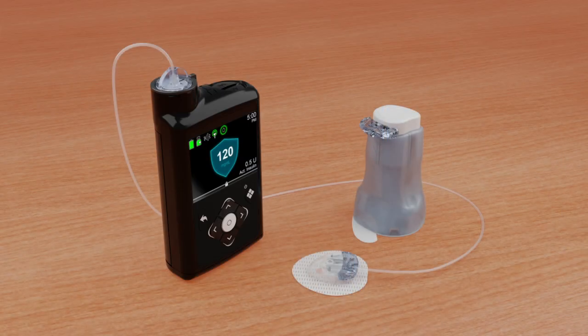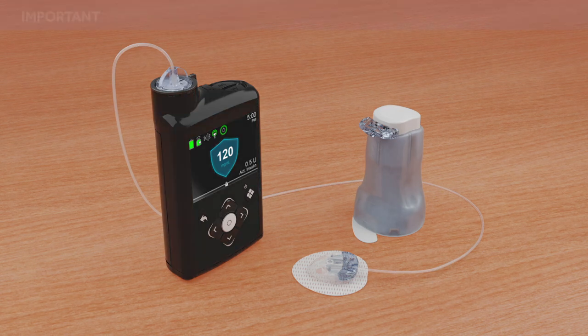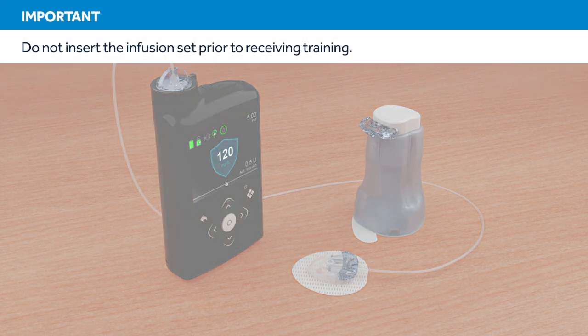This video will show you how to fill the reservoir and insert the infusion set. Do not attempt to insert the infusion set prior to receiving in-person training.